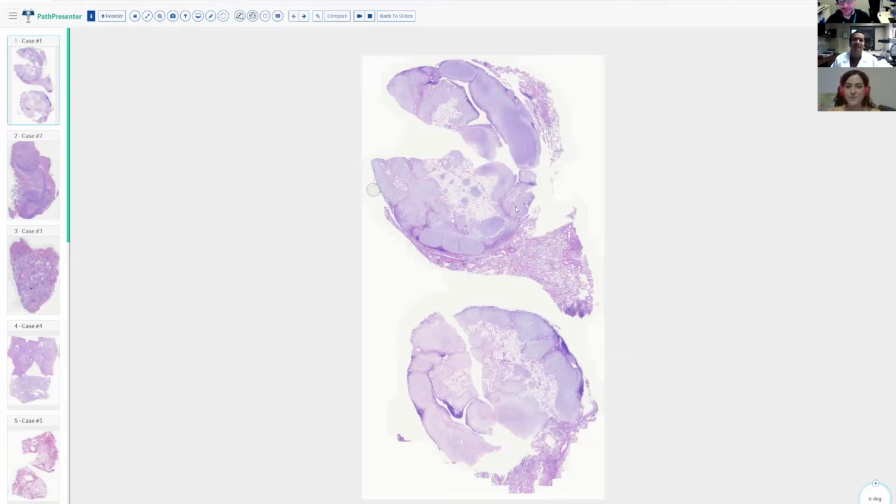And so today we're going to do some spotter cases. In these spotter cases, these are cases that you can diagnose based on just the H&E stain alone in about 1 minute or less. And so these are types of questions that might commonly appear on different in-training exams that you might have during your residency training, and are important cases to know for practice as well.